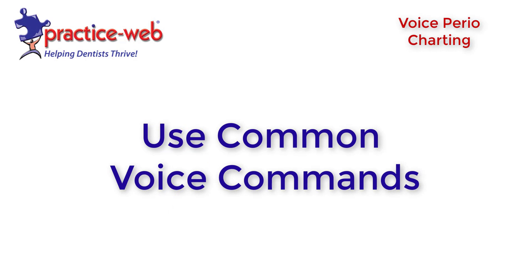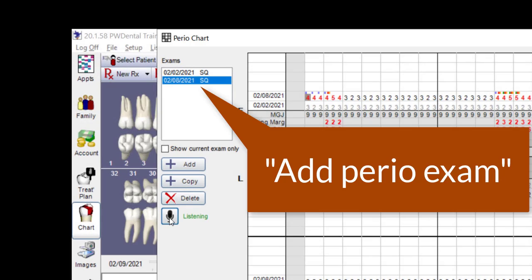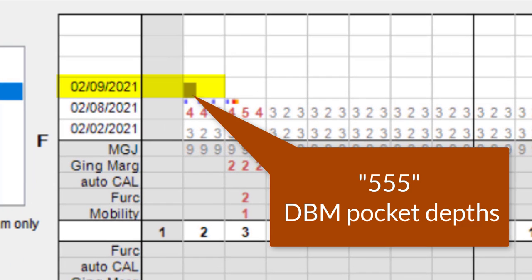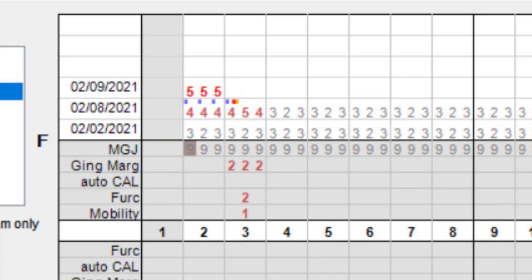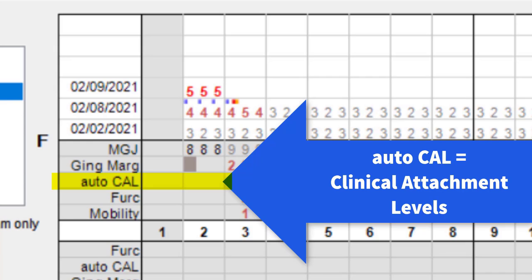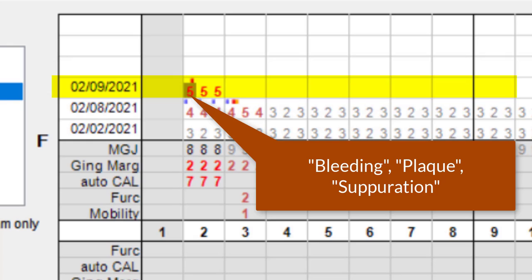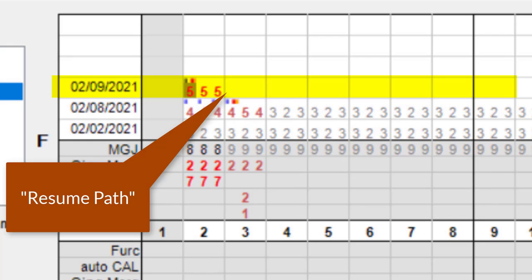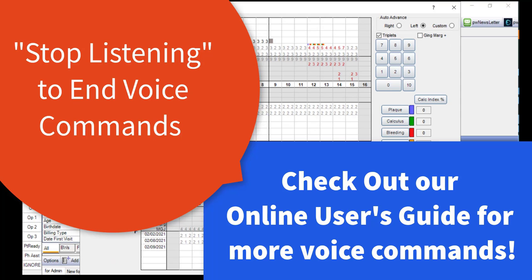Now let's see how to use the voice perio feature through common voice commands. Commands demonstrated include: 'Add perio exam', entering pocket depth values like '555', gingival margin entries like '222', selecting a tooth and surface such as 'Select number 2 distal', and findings like 'Bleeding', 'Plaque', 'Suppuration', 'Resume path', entering values like '444' and '323', using 'Triplets' for repeated values, and finally 'Stop listening' to end the session.